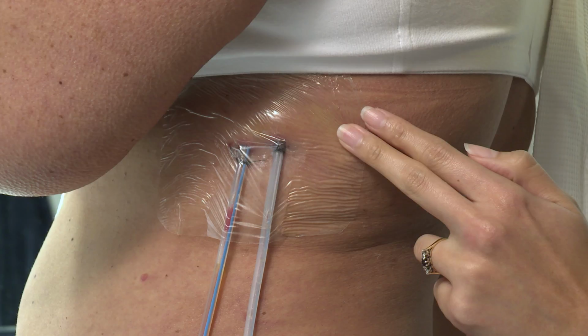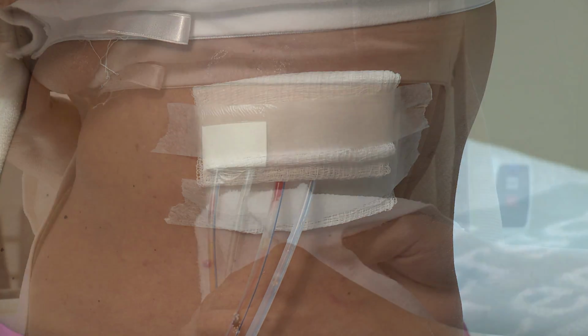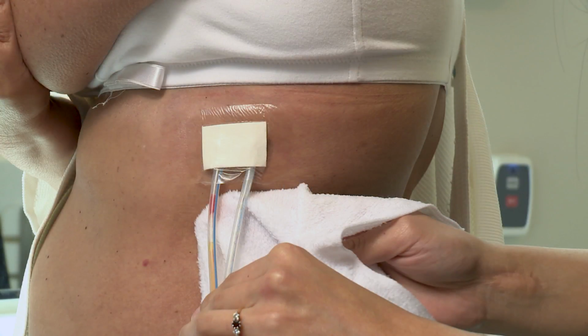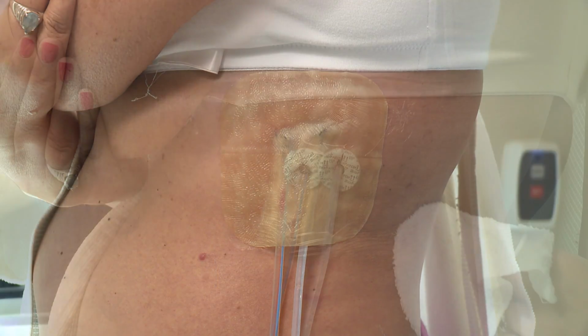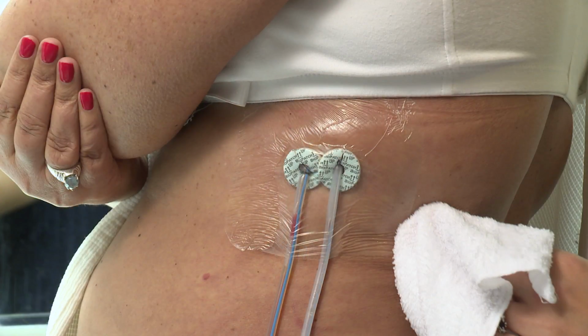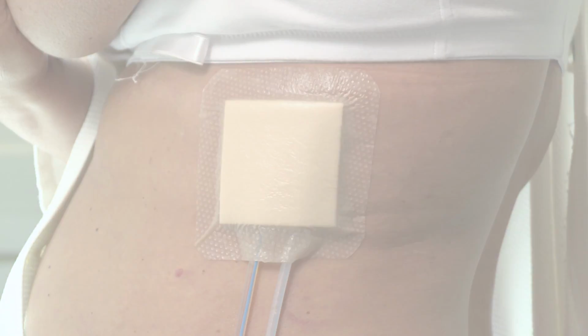There are many ways to dress and care for the drain insertion site. There are also different types of dressings. Depending on what your surgeon has chosen for your specific needs, care of the area will vary. Please follow the instructions specific to your type of dressing.